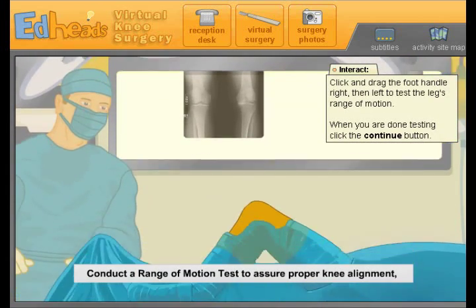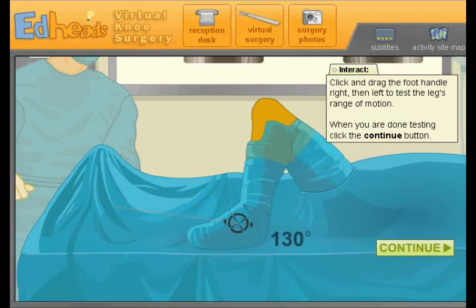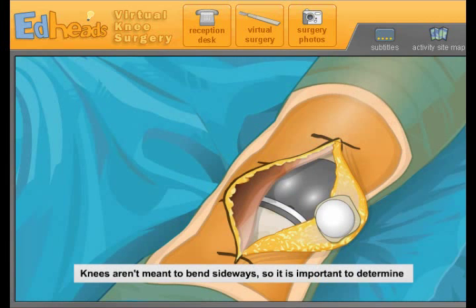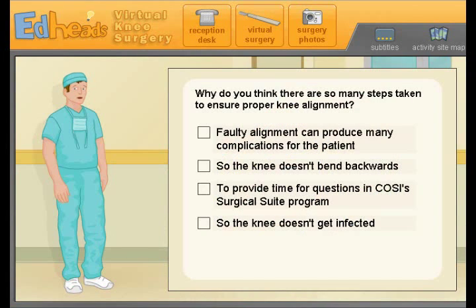Conduct a range of motion test to assure proper knee alignment and successful prosthetic fit. Typically a normal range of motion allows the leg to move from 0 to 130 degrees. He can bend from 0 to 130, so that's always good — knees aren't meant to bend sideways. It's important to determine whether there is a gap or space between the femoral and tibial components. There is no noticeable gap, so this knee is a good fit. Why so many steps to ensure proper alignment? A faulty alignment can produce complications — we want to make sure his knee doesn't bend backwards.